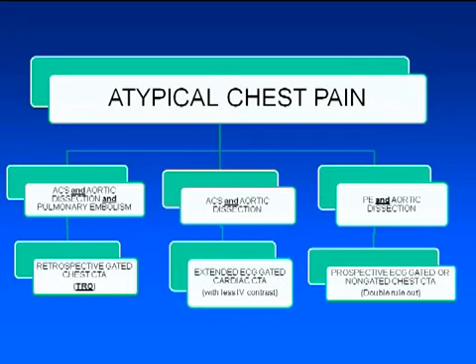So if you go from your right-hand side to the left, you have to think about what the possibilities are in this specific patient, what can be going on. If you think the patient has a pretest likelihood of having pulmonary embolism and dissection, but you're not thinking about coronary syndrome, you shouldn't do a triple rule-out. You can do a prospectively gated dissection protocol and extend your bolus of contrast to opacify both circulations. You can even do a non-gated CT for dissection, as many places do. As long as you have a longer contrast bolus, you're going to be able to opacify both circulations at the same time.